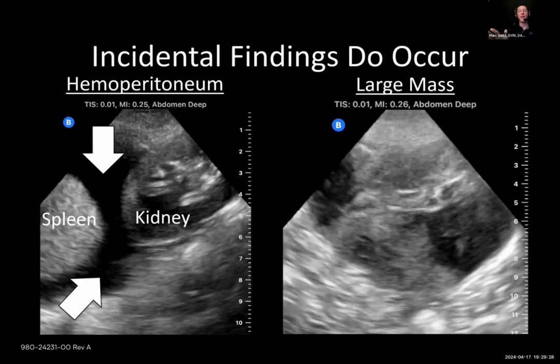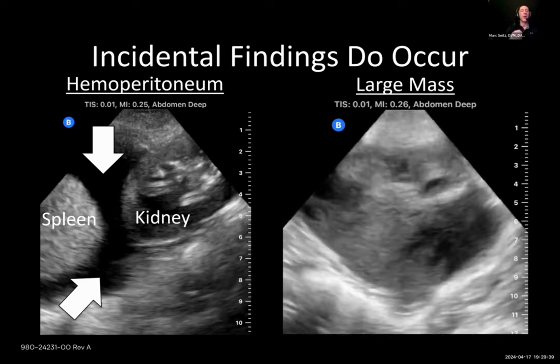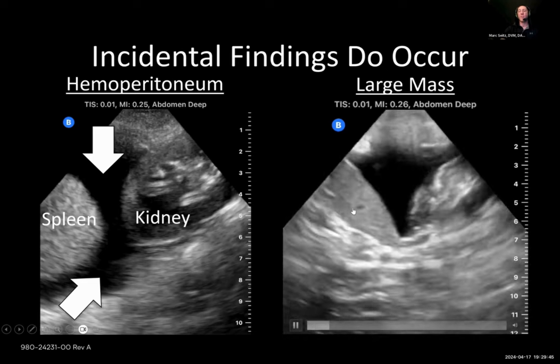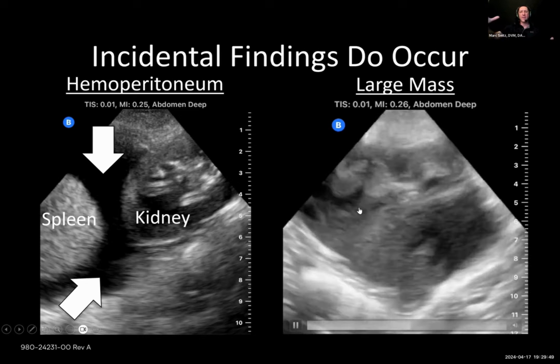So this is another example of something that we're going to broach at the very end, and that's incidental findings. The nice part is if you start doing enough of these, you're going to start to learn, oh, this is what a normal spleen looks like. This is what a normal kidney looks like. And even if you aren't confident making the diagnosis, on the video on the right that I'm showing, very clearly we have this spleen that's normal for an instant, but then it segues into this large irregular mass.